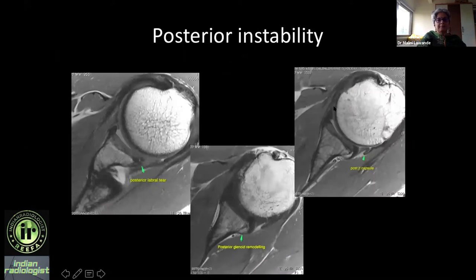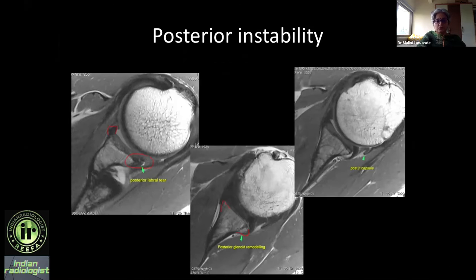When you see a labral tear, it's not enough to just call it a labral tear — look for the cause. Here I can see osseous remodeling at the posterior inferior glenoid. Combined with a posterior labral tear and a lax capsule, all three together should prompt you to ask the surgeon to assess for posterior instability. Look at the pattern.